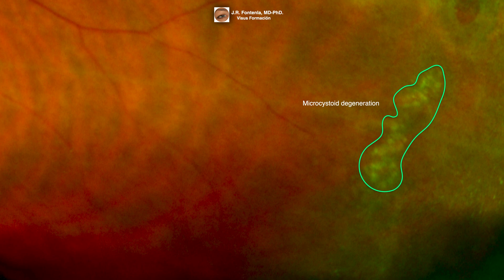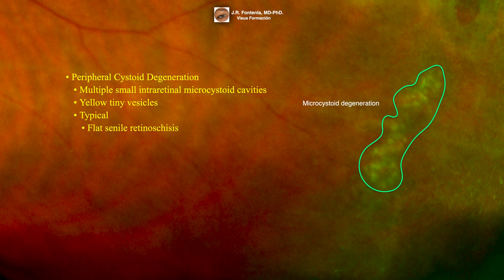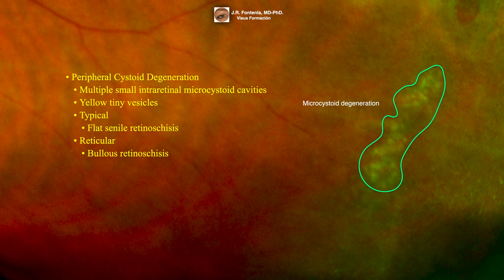Here we can see a microcystoid degeneration. Peripheral cystoid degeneration is defined as multiple small intra-retinal microcystoid cavities, most frequently seen in the temporal peripheral retina. Characteristically, they are yellow tiny vesicles with blurred borders on a grey background. The typical form occurs in adults and may be complicated by fusion of cysts, development of cavities in the outer plexiform layer, and flat senile retinoschisis. The reticular form occurs in 18% of adults and may be complicated by bullous retinoschisis with cavities found in the retinal nerve fiber layer. This form is almost always found posterior to typical peripheral cystoid degeneration and tends to follow the retinal vessels.